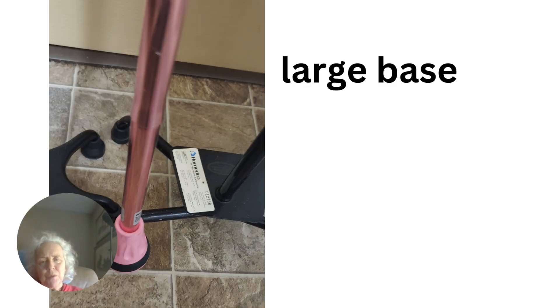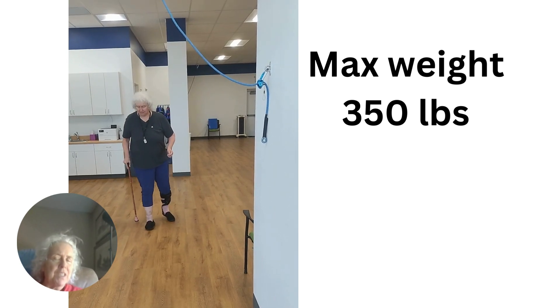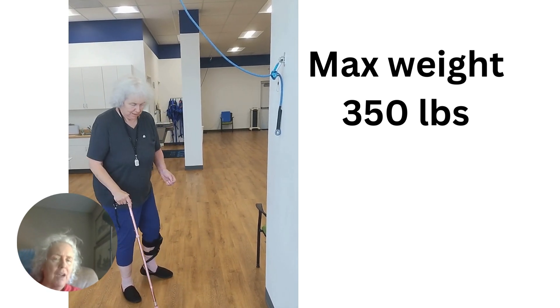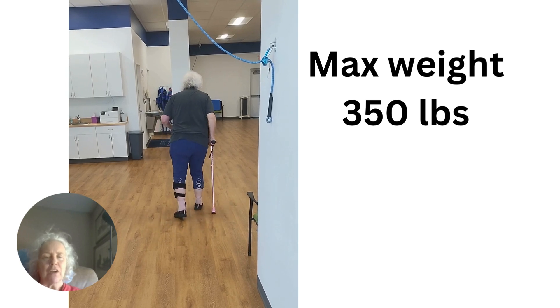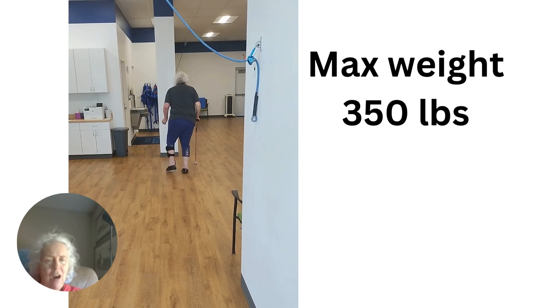Another thing I like about the ReHand single point cane is it's got a large base on the bottom. If you get one that just comes down to a point, it's not very stable, but this one has a base that's large enough to give you the balance you need without getting in your way. This is me walking with the ReHand single point cane — it's not pretty, but considering it took me a year to be able to do that, I'm right proud of it. Every once in a while I catch my stride, and I know that if I work enough with this cane, soon I'll be able to wean myself off it, just like I weaned myself off the quad cane and hemi walker. Once I wean myself off the last cane, I'll just be walking by myself — and I'm looking forward to that day.